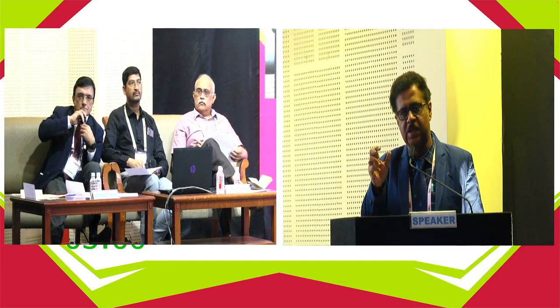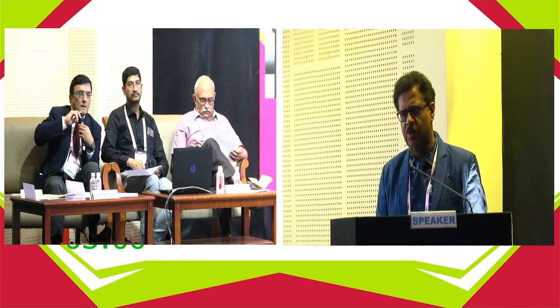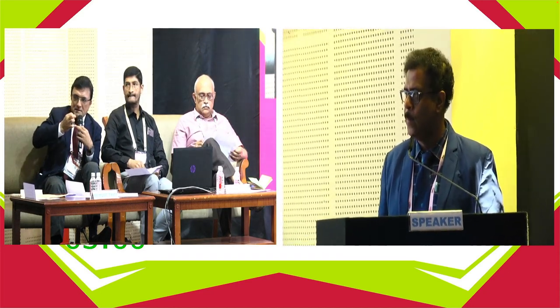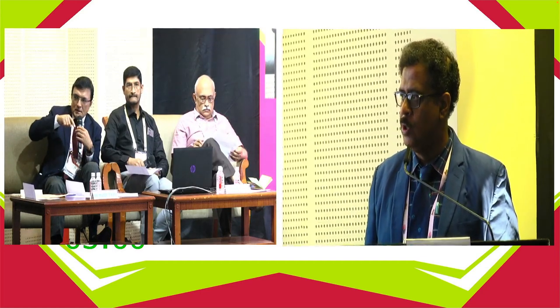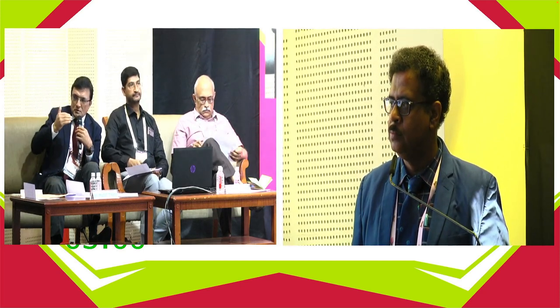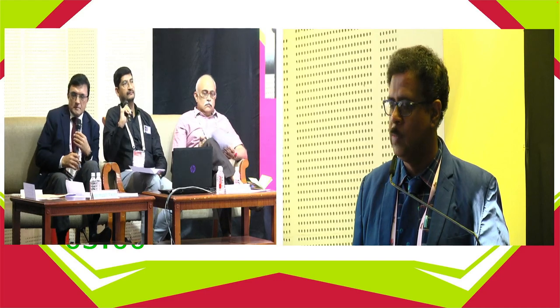But it varies. It is 200 to 400. 200 is good enough for injection. I think what he is doing is going into the tuberculin syringe. It is self-locking, because the diameter is such that it fits into the inner diameter of the tuberculin syringe so that it doesn't leak. And the pressures you're using are not very high. You use a pressure between 5 to 10, maybe that much. You can test it outside by a drop.